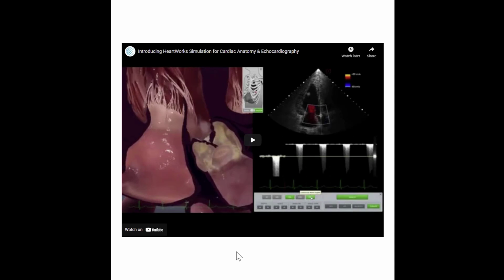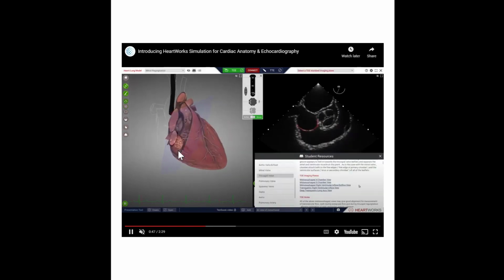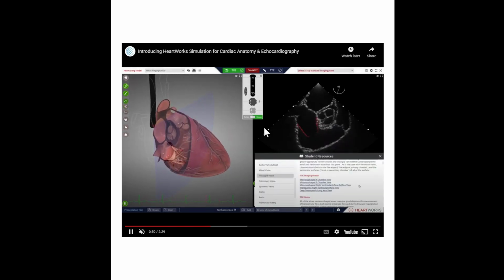And then I have another clip that I linked to in your workbook of a different company that you can check out. This one is a TEE and a TTE simulator. So not only does it show you like 3D models of the heart and how to image and Doppler these structures, you can then practice on a soft tissue phantom using a special transducer that kind of shows you what you're doing in the TTE, or you can place a TEE transducer and kind of get some more practice with that. So this first little clip is the TEE probe being behind the heart in the esophagus, and you get to see kind of a simulation of what it would look like.